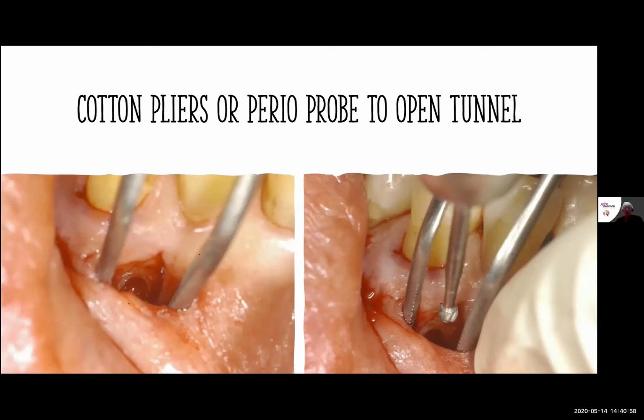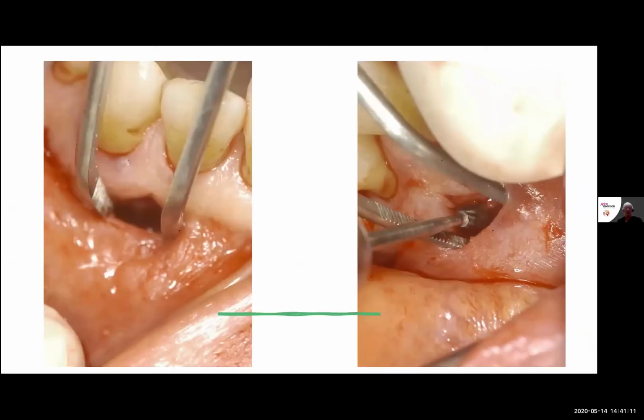And as you do that, you don't want to use your best cotton pliers. But cotton pliers work well to help hold and to open the tunnel. Using a perio probe that you're going to extend into the tunnel is another way of doing that. And so you're going to open up the tunnel, and then from there, you're going to insert your handpiece and your burr. A great assistant that can retract the lip and cheek works perfect for this particular technique to help us out.